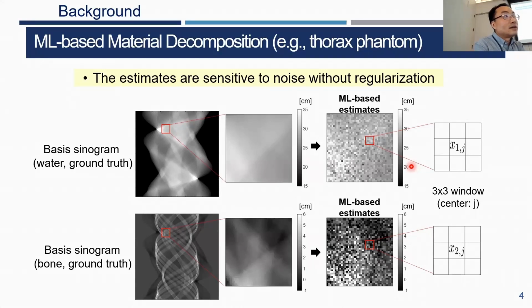In the image domain, usually the pixel right next to it gets more weight than the diagonal pixel, because the farther away, the more deviation. But in the sinogram domain, neighboring elements do not necessarily mean they are next to each other in the image domain.